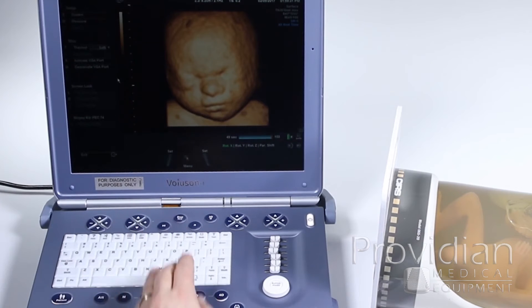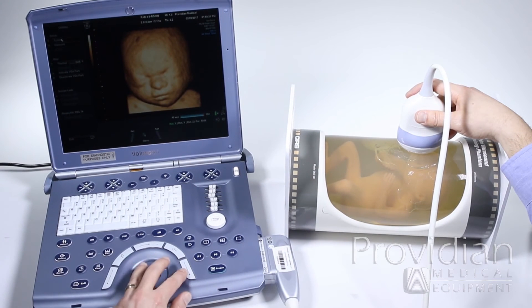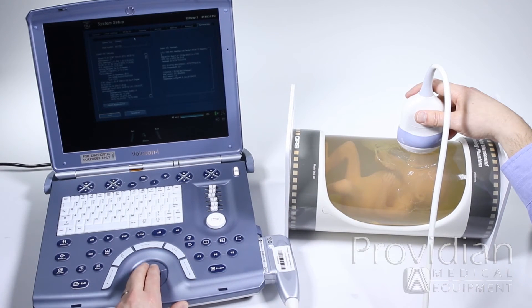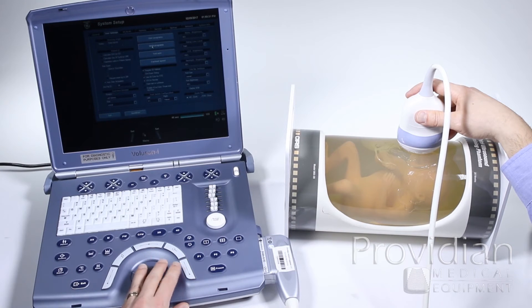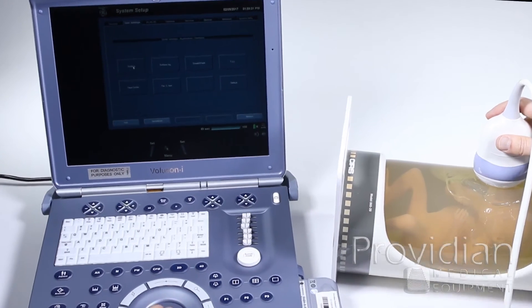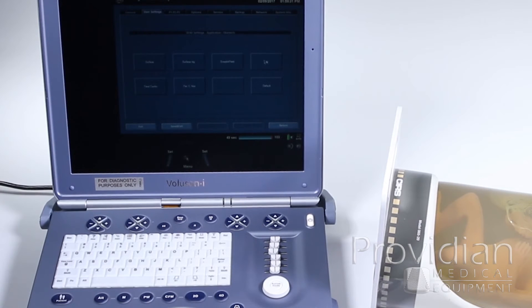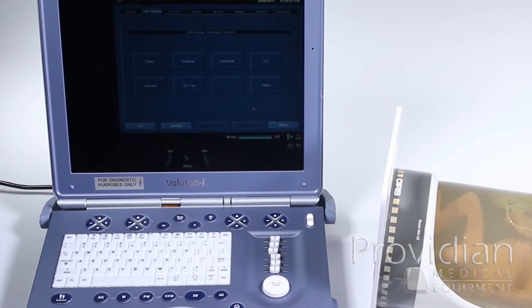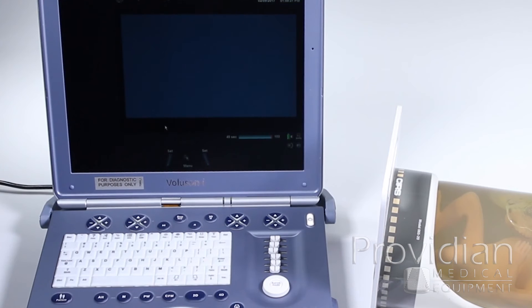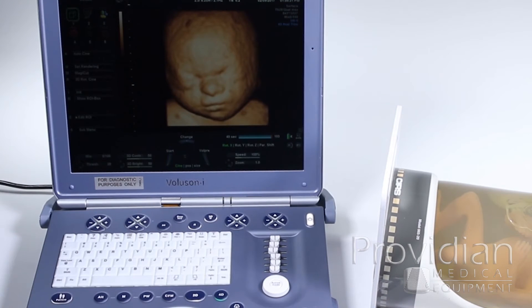Freeze the image, press Utility, go to System, User Settings, 3D/4D Programs, and you can overwrite any of these. I highly recommend leaving Surface and Surface Big in case your settings ever get lost. Usually it's the third setting — TUI, fetal cardiac — if you don't need those. There's a blank one down here you could use. I didn't make any changes, but I can exit that and go back to 4D imaging.